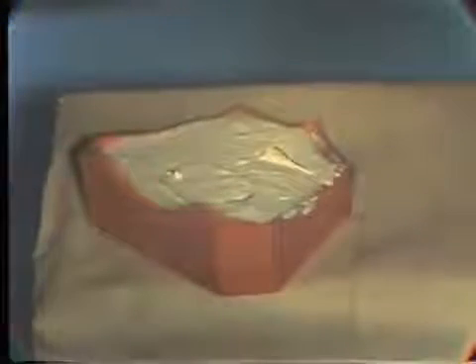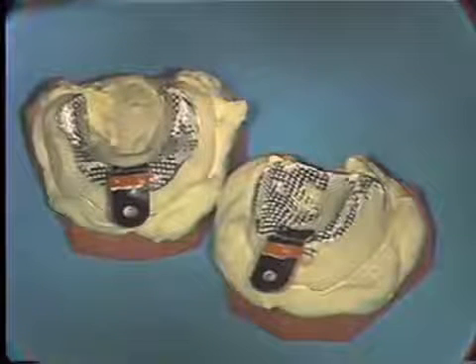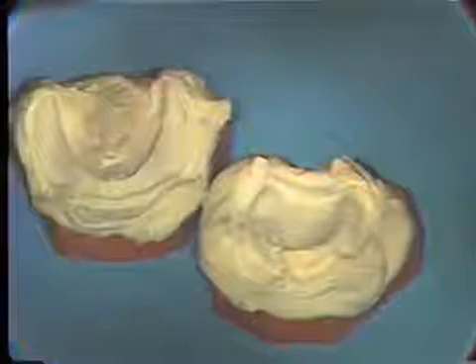A base former is filled with the mix of 1/2 stone, 1/2 plaster, and then the maxillary impression is placed into this mix. After pouring the mandibular impression similarly, being careful to clean out the tongue space on the mandibular impression and allowing the stone to harden, the impressions from the casts can then be separated. The preliminary cast can then be removed from the base formers.